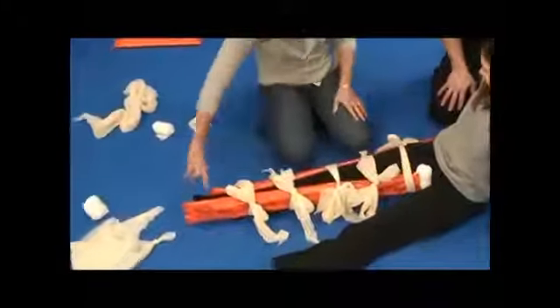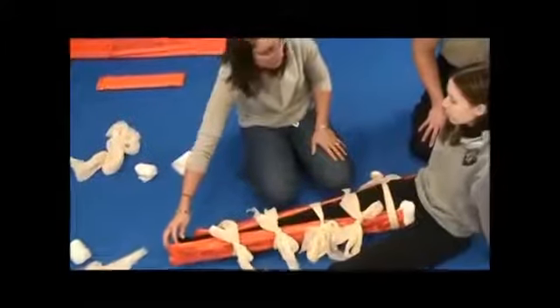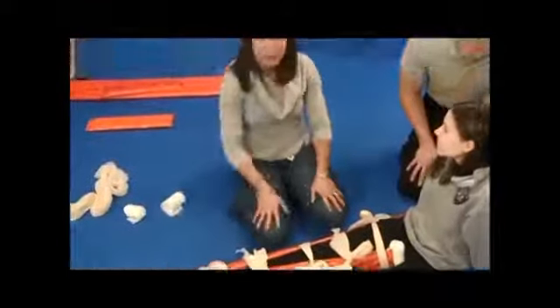Once I have those in place, I'm going to check my pulse again. Ma'am, can you wiggle your toes? And which toe am I touching? Big toe. And we're done.